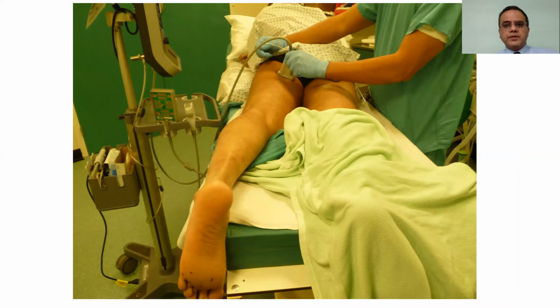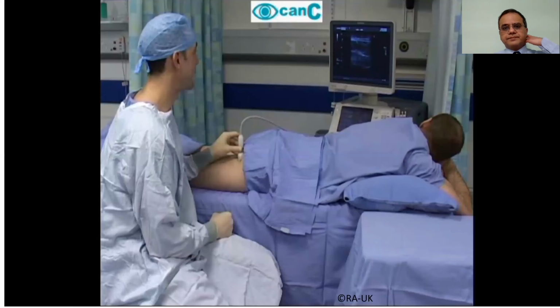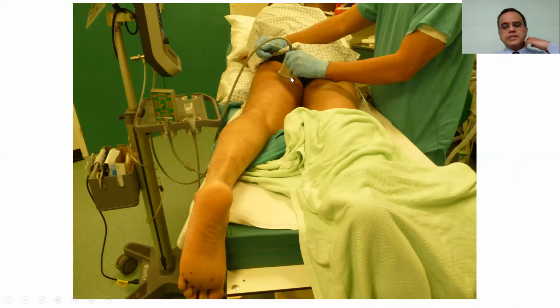So you can use a linear probe for this because the nerve is not that deep. Again, everything is in line. Needle is introduced in plane.